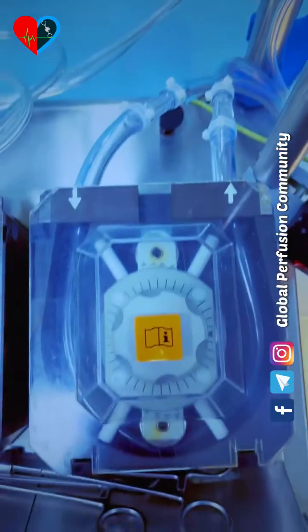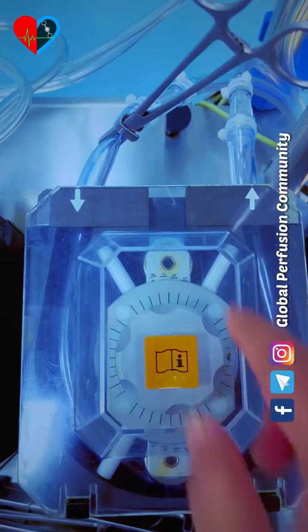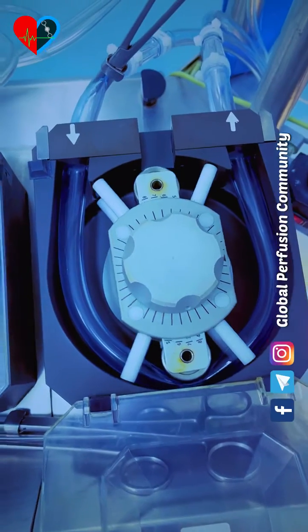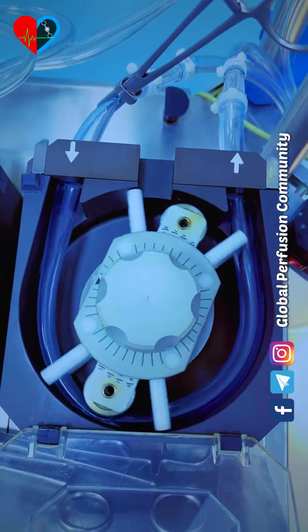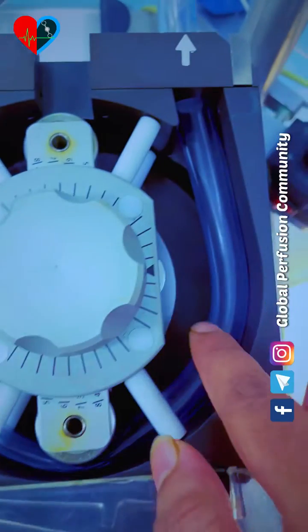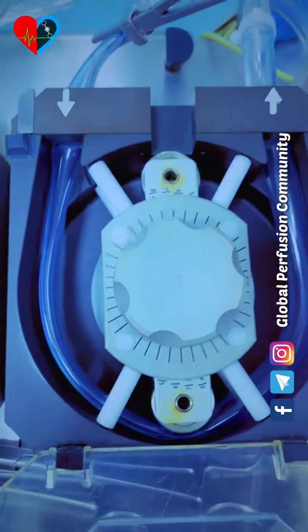The first thing you need to do is clamp this reservoir outlet. Now slowly rotate the roller pump. You will see the tubes are squeezed — the tube is compressed. And we said the tube is not compressed, so next, let's see what you need to do.